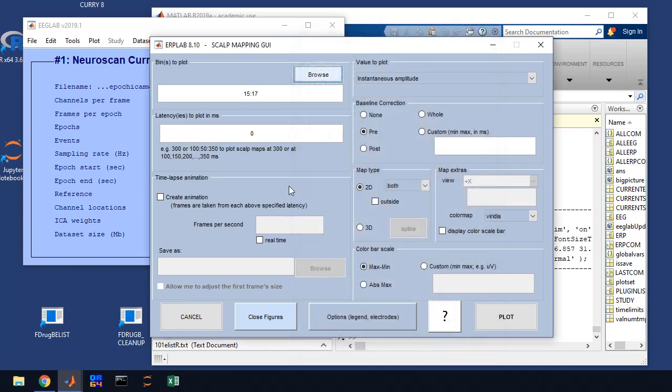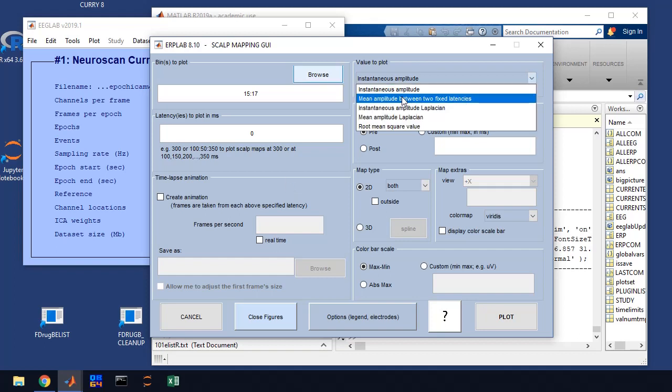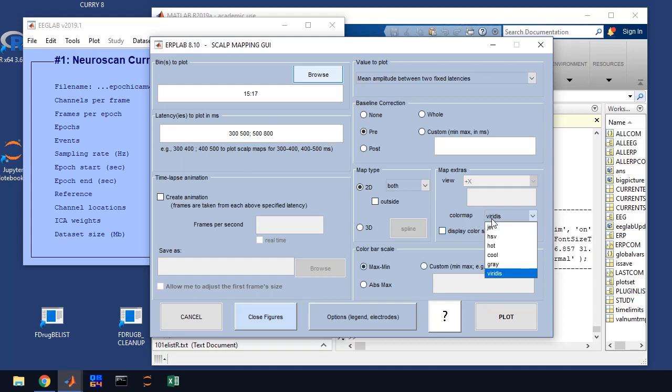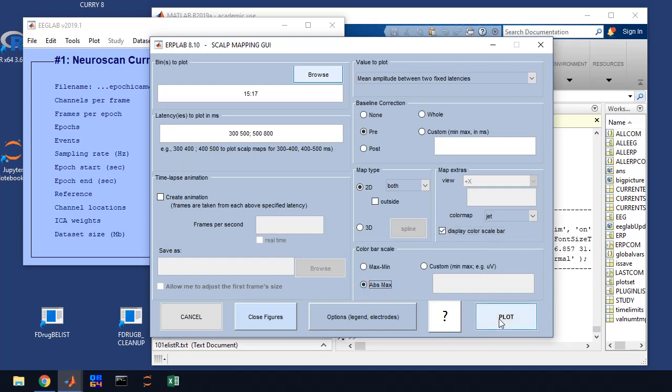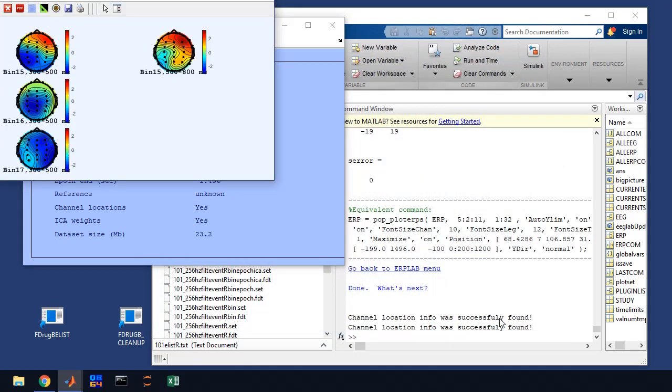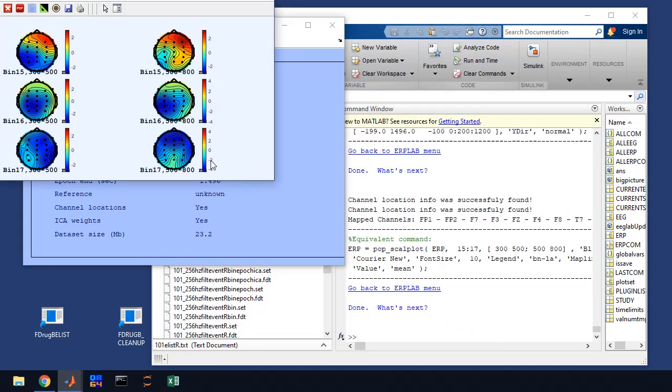And we're going to do a mean amplitude between two fixed latencies. And then we're just going to do 300 to 500 milliseconds, that'll capture the FN400. 500 to 800 milliseconds, that captures the LPC. And so we'll just spot check the FN400 and LPC for those two tests. We're going to color map, select jet, display color bar. And then I usually click the absolute max and min for each map. And it will plot up these maps for you.